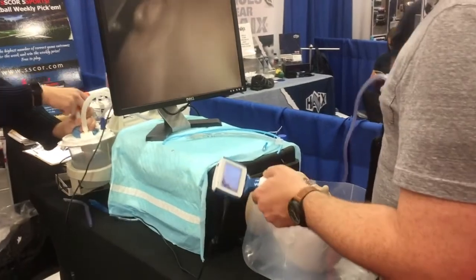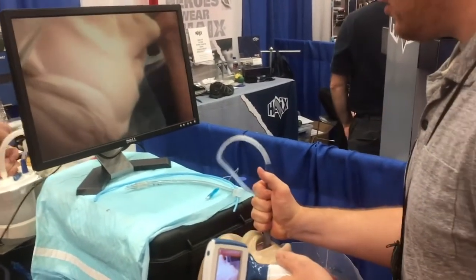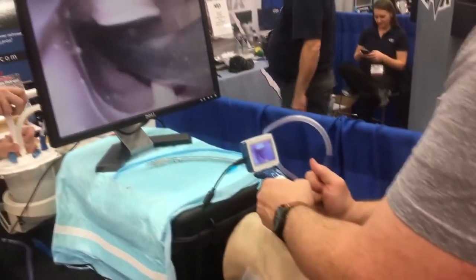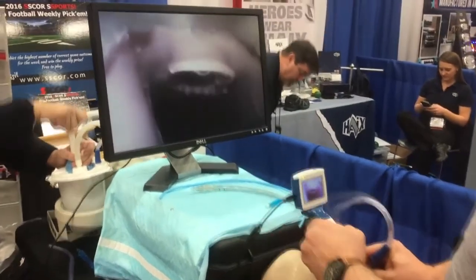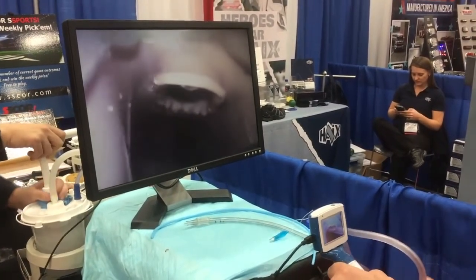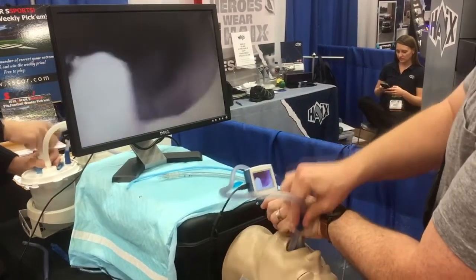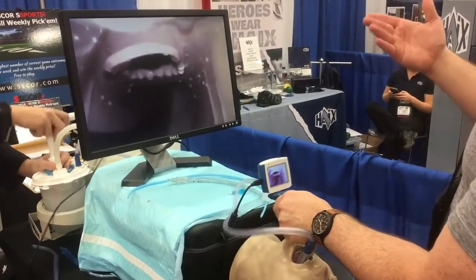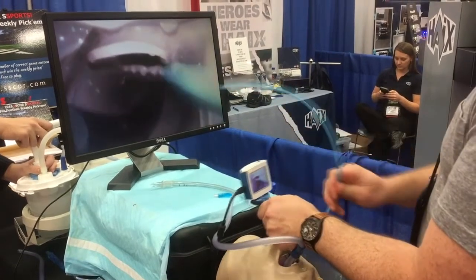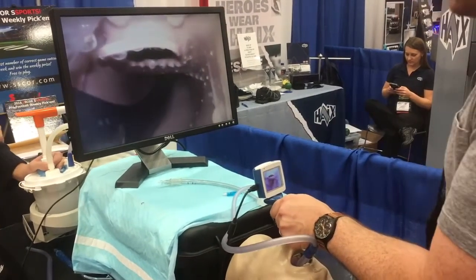So he's using a McGrath blade here, but any video or direct device works. The sucker is put in using this sort of alternate grip, and it's just rammed back into the pharynx. And then we use the video to see what we're sucking down into the oropharynx and then into the airway if needs be. And then what he does, it's difficult for you guys to see on the screen, I think, but he rams the sucker down into the top of the esophagus. The problem then is that blocks the view, so he actually just switches the sucker over to the other side, so it's to the left side of his left hand and not in the way of intubation, and then just does a bougie-assisted intubation with the sucker still down in the top of the esophagus. You can't see it, but that's the sucker there.